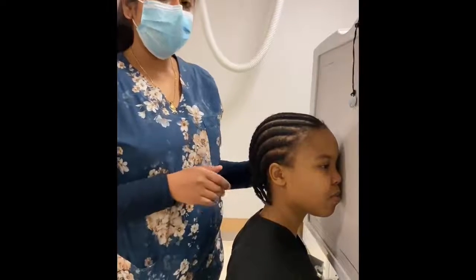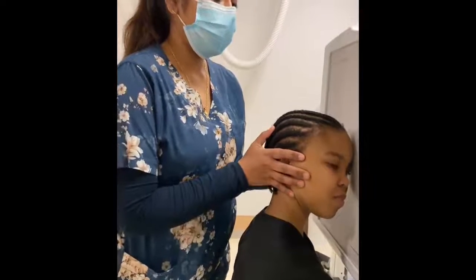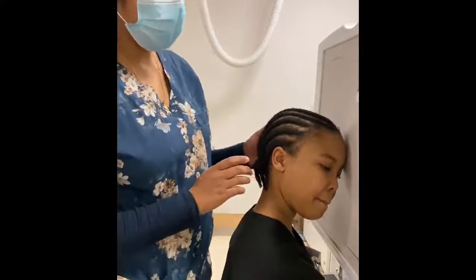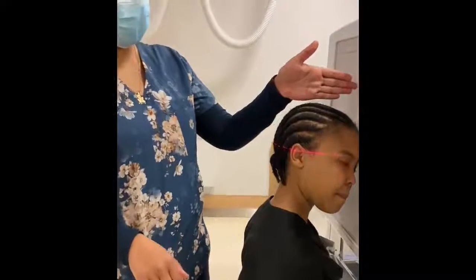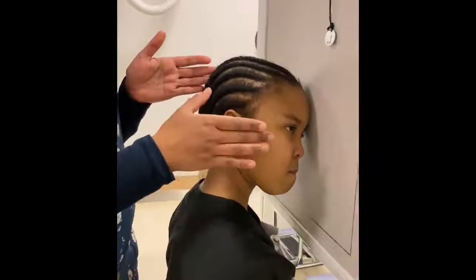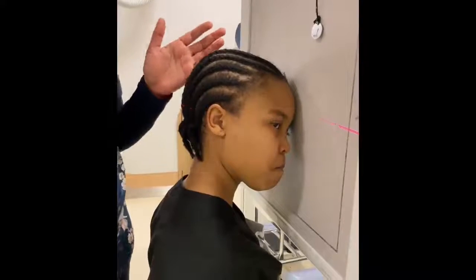Then we need to rotate the patient's head about 37 degrees, more or less around this area here. And basically from the mid-sagittal plane, more or less around here, to the portion that is against the image receptor, that angle needs to be about 53 degrees.